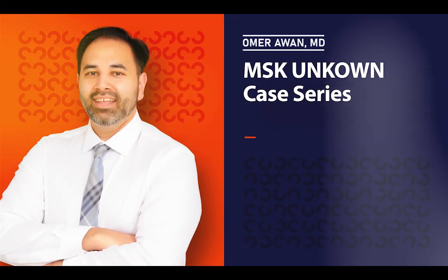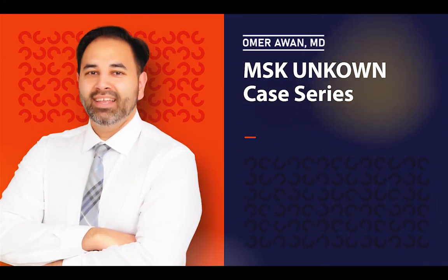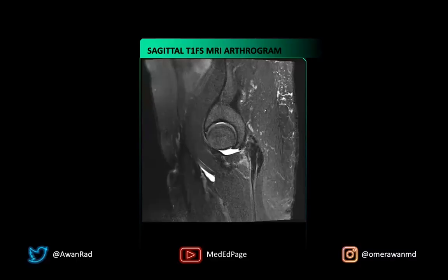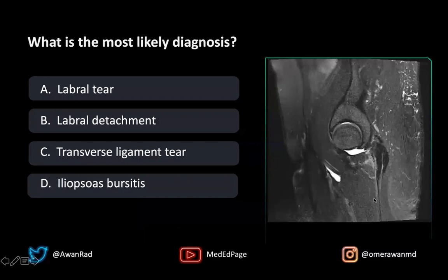Hello everyone, and welcome to MSK Unknown Case Series, Case 86. Here we have a sagittal T1 fat sat MRI arthrogram through the hip. The high yield question here is: what's the most likely diagnosis?